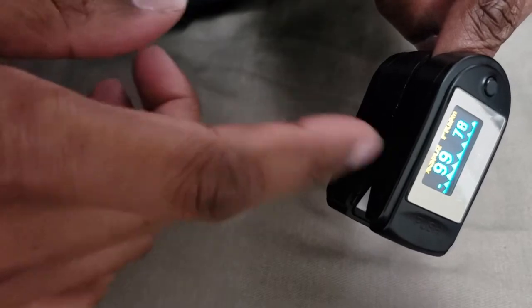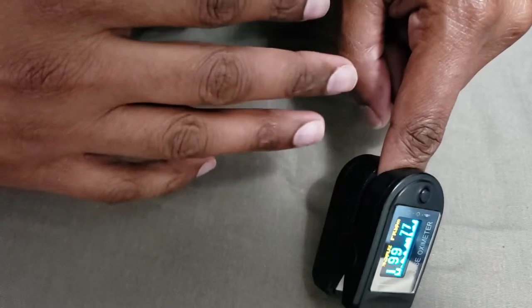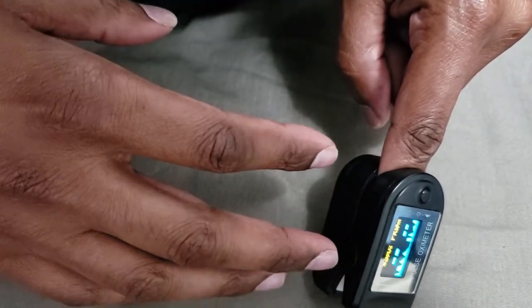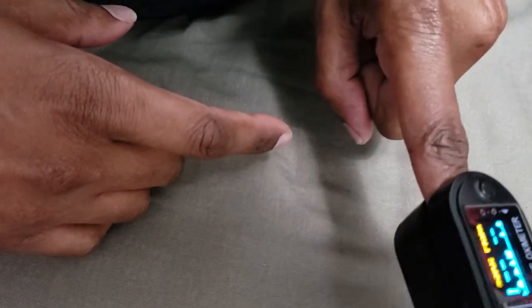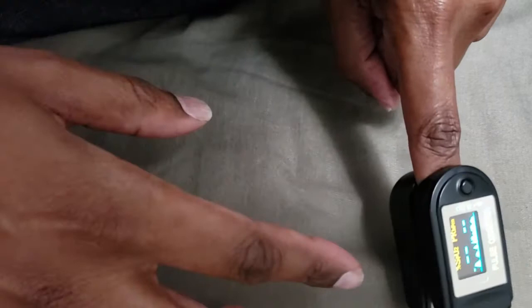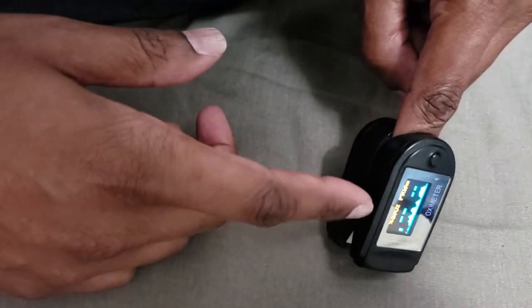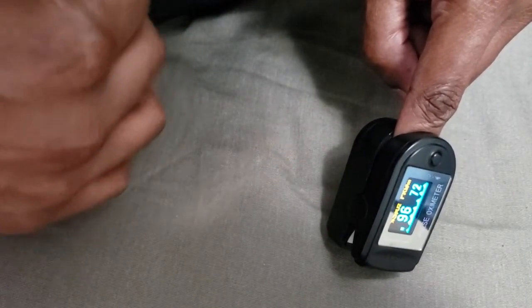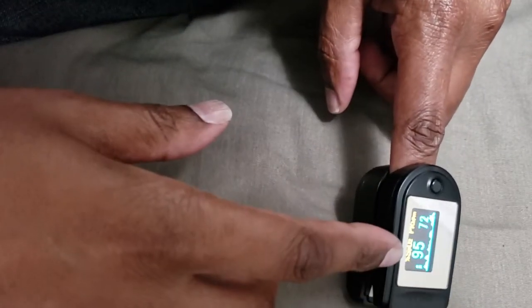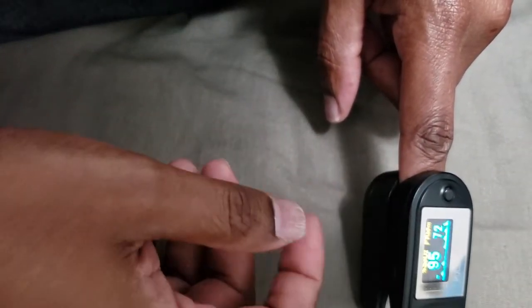And another thing you can do is check when you're walking. Now, I know I just said use it while you're sitting still, but what you can do is check while you're walking. You put your hand up, hold it in front of your face and walk, and see how much this drops down. And sometimes the doctors call that walking pneumonia. So it might not show up while you're sitting, but it might show up while you're walking. And you can see this is dropping down for whatever reason, right? Because I moved it around.